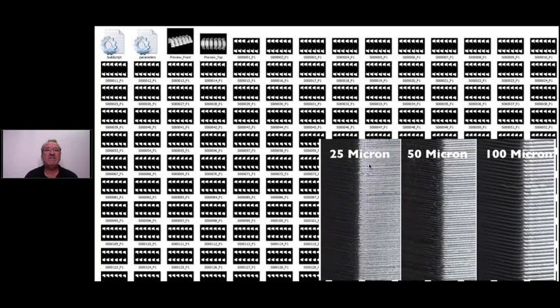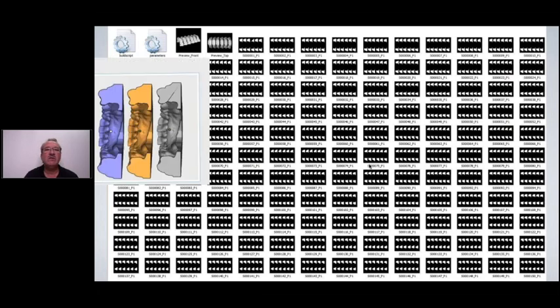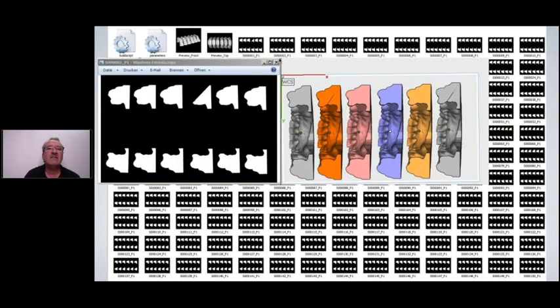Now, when we have these slices, you can examine them. Sometimes you will see, especially on this slice here, there's a mistake here. I hope you can see this. It's this one. There's a little bit missing here. So that means this model was not completely flat, so it'll misprint the first thing here. We can see it on our software. Okay, we can check this.